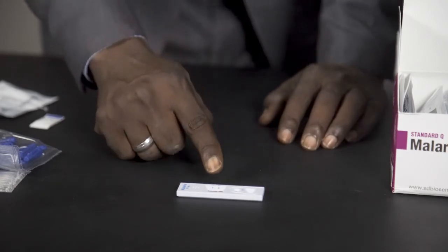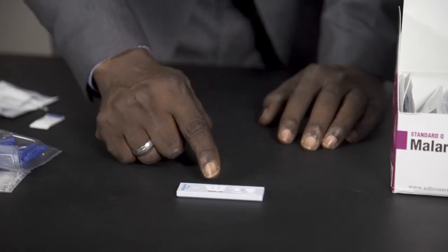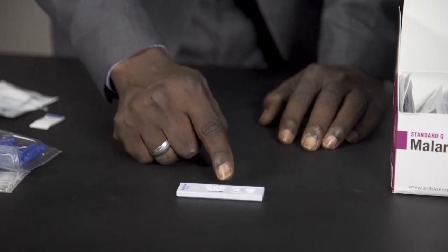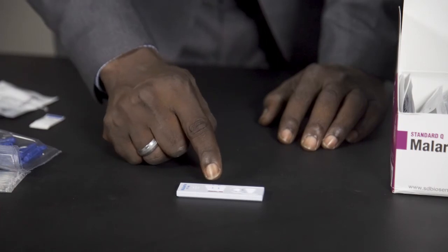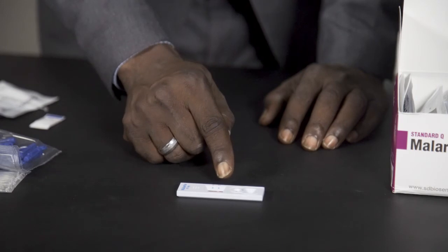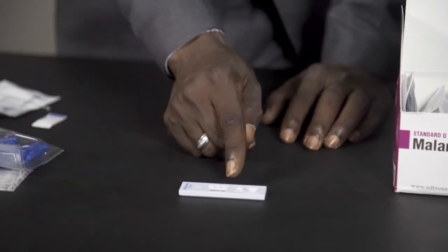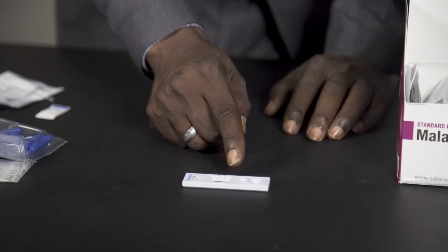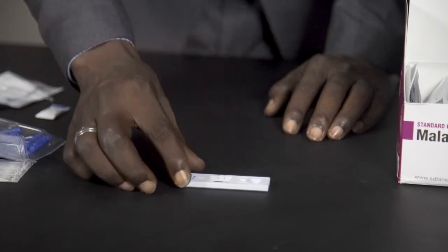To read the results, there must be a line on the control line. You can see on the kit you have the C, which is the control, and the PF. There must be a line on the C — it means that the test was conducted in the right way. If it is positive, there will be another line on the PF. If it is negative, there will be no line on the PF.